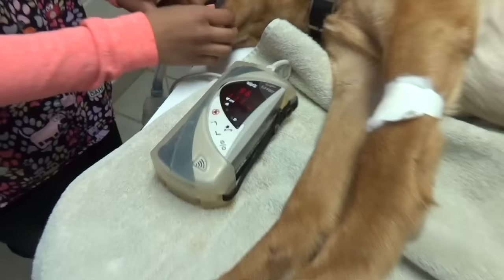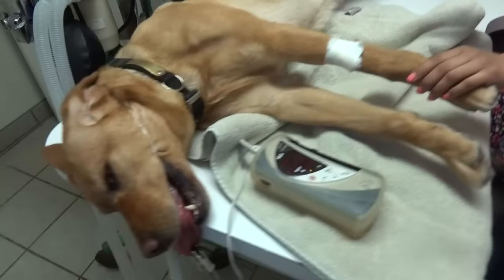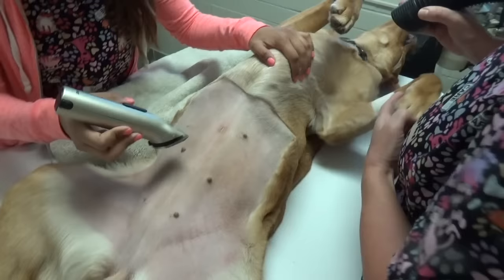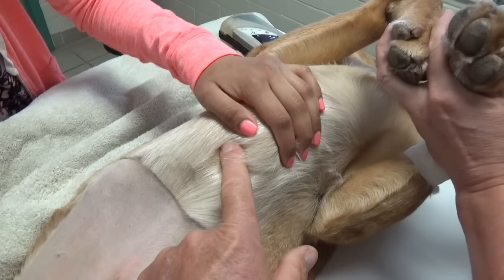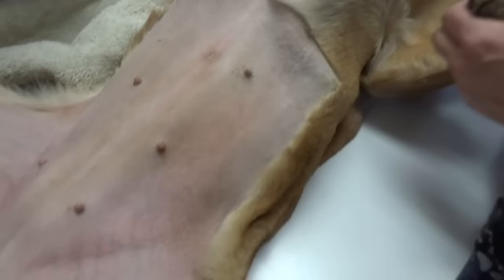So we'll shave her up in this room and then we'll take her in the other room and prep her up. So then she's prepped up and you can tell we have a wide area. Clear up here's the start of her ribs, coming all the way back almost down to the vagina. And the incision is usually right in here. So we want a wide area so we can get all the bacteria away.